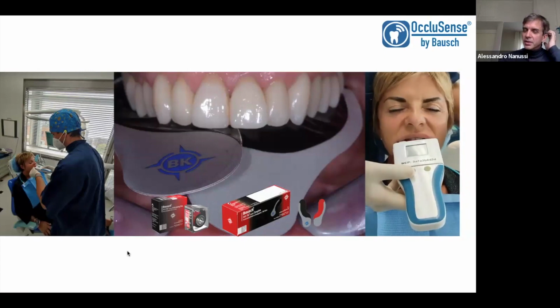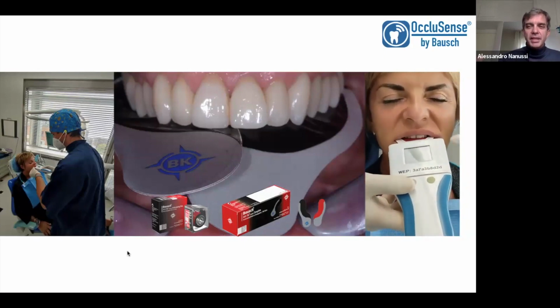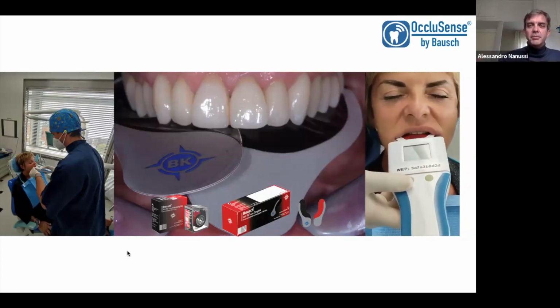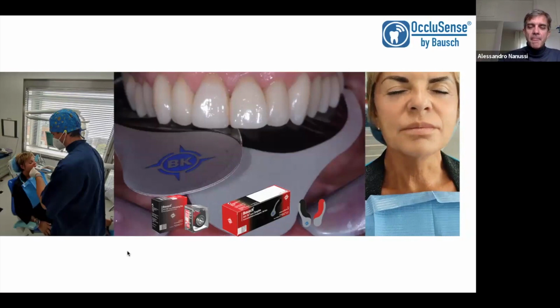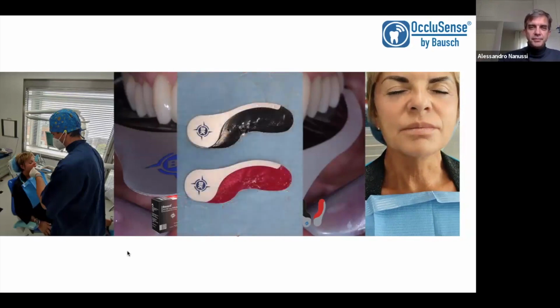We can do a check of the maximal intercuspation and also of the movement, anterior and lateral movement. 20 seconds is possible. You need less time than 20 seconds, but with 20 seconds, everybody can move and roll. Look at the papers after the check. It's interesting because you never find a hole in the paper.